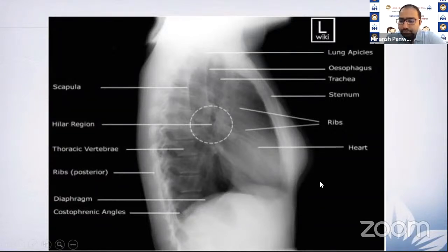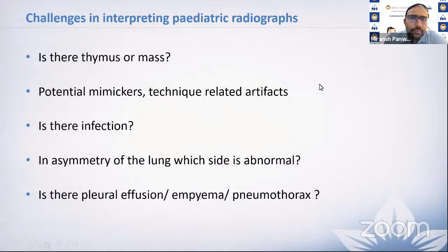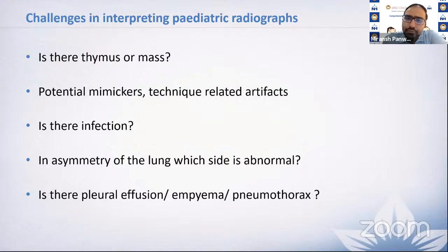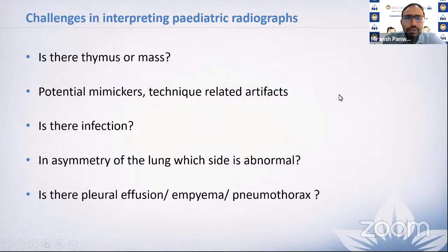The major challenges when assessing pediatric radiographs are: first, whether a finding represents thymus, mass, or consolidation — a big problem, especially without awareness of thymic variations and potential mimickers. Second, differentiating viral versus bacterial infection on X-ray. Third, whenever there is asymmetry of lung fields — one lung more opaque or more lucent — determining which side is abnormal. These are the key topics we'll cover today.